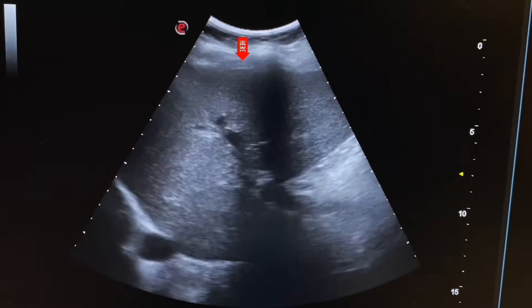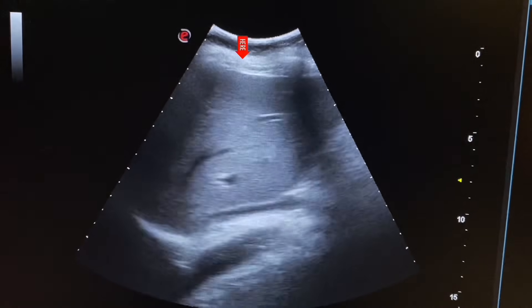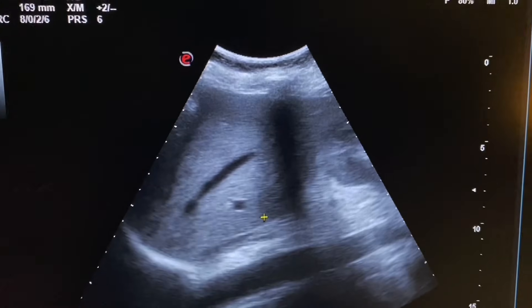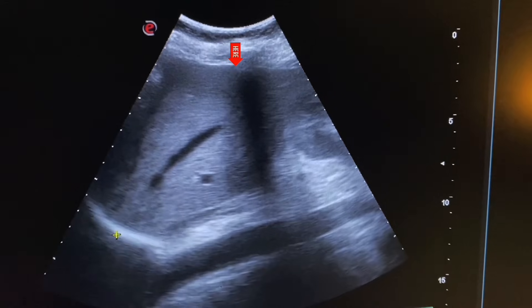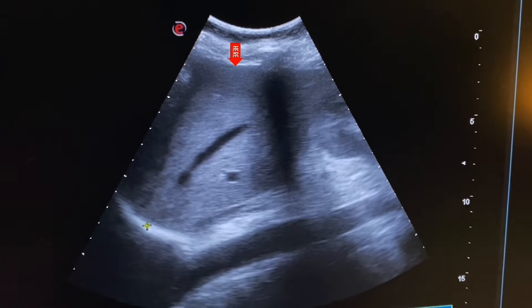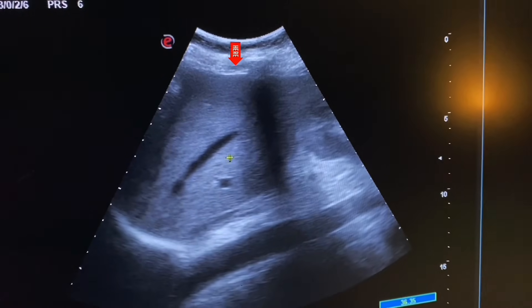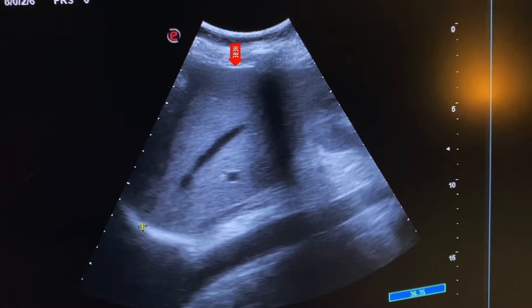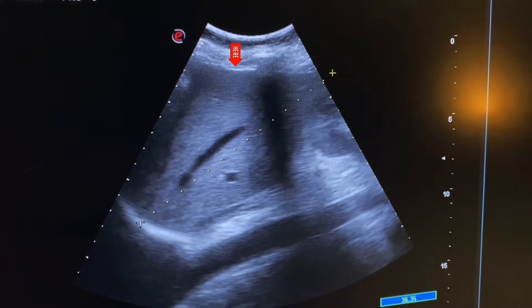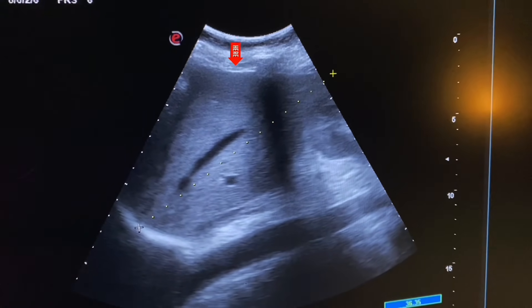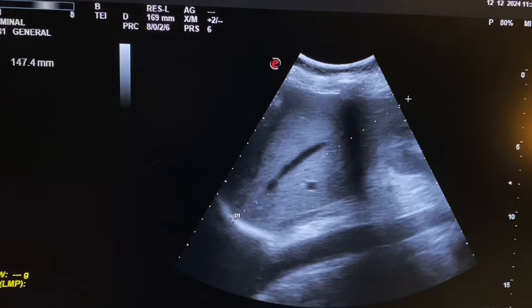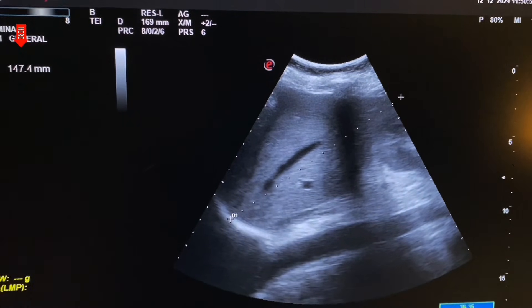Now at the lumbar area, placing the probe we see the craniocaudal view of the liver. We will now measure the size of the liver. A craniocaudal measurement is needed for liver sizing. The craniocaudal view is obtained by placing the probe at the right lumbar area with the probe direction towards the epigastrium. The size of the liver is 147 millimeters, or 14.7 centimeters.